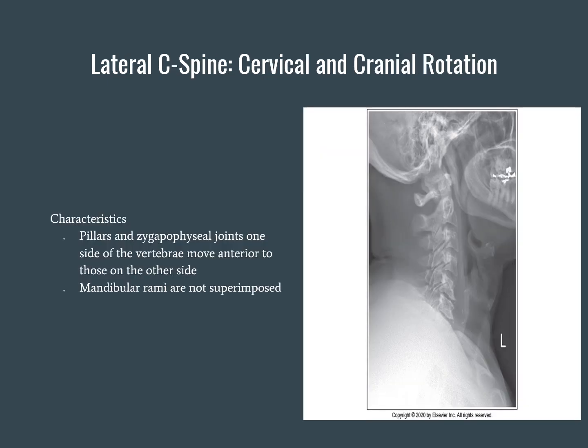So let's talk about lateral C-spine projection and rotation.